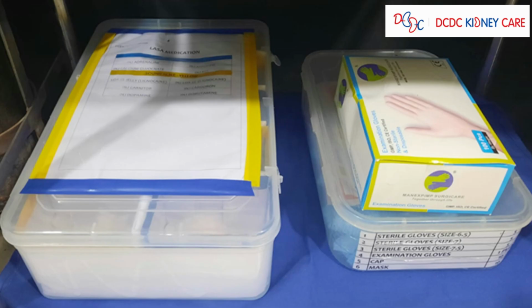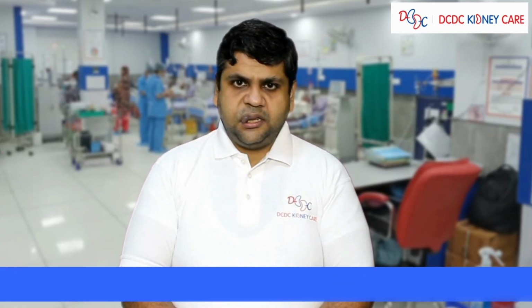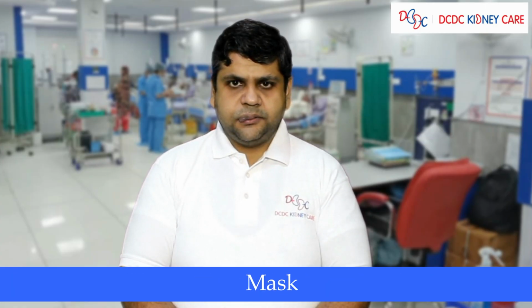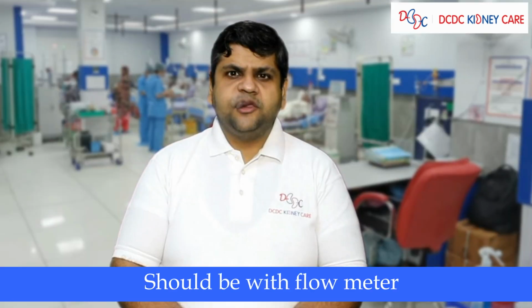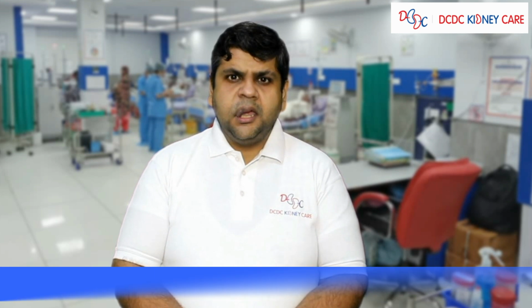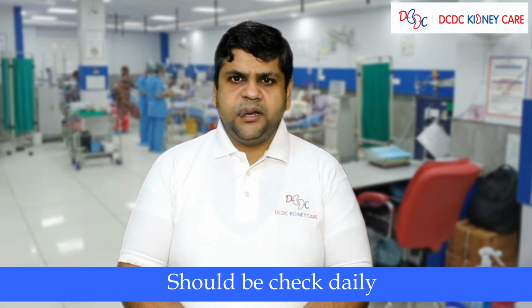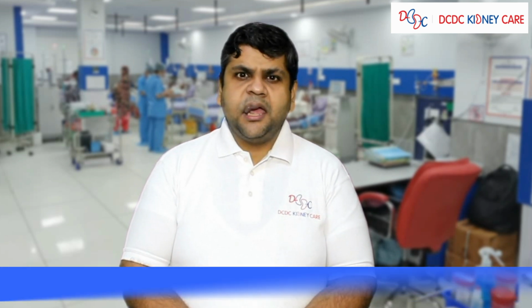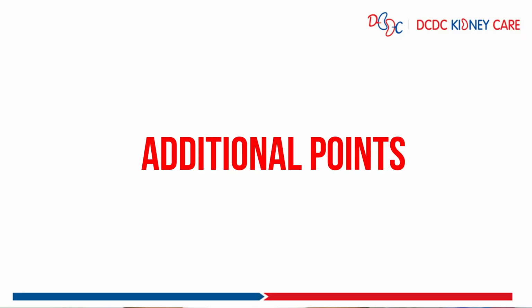Bottom shelf. We have gloves, examination and surgical, cap and mask. Oxygen cylinder. It should be filled, it should be with the flow meter, and it should be checked daily, and the water in the flow meter should be changed daily, and the filling date should be mentioned on a daily basis.